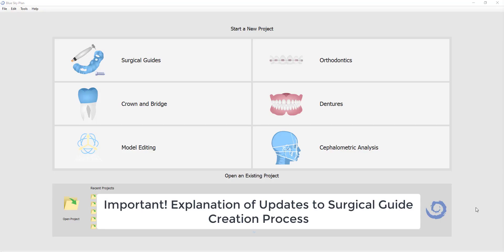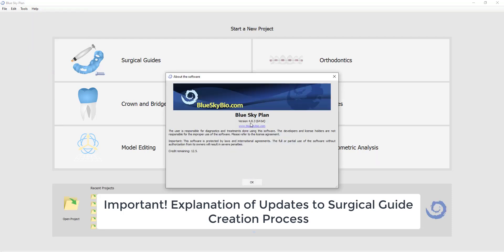This is Michael Saltzman from Blue Sky Bio. I would like to address an important update that we've made to the Blue Sky Plan software, part of the surgical guide creation process. This is an important video as it affects the process flow when creating a surgical guide. I'm using Blue Sky Plan version 4.83, which is the live version currently available from the Blue Sky Bio website.